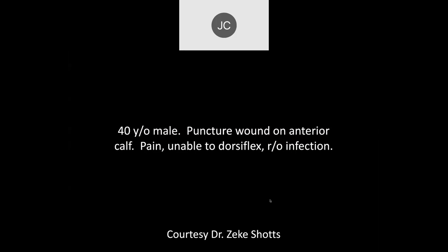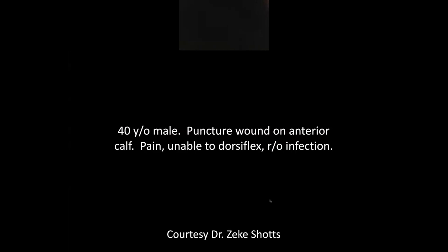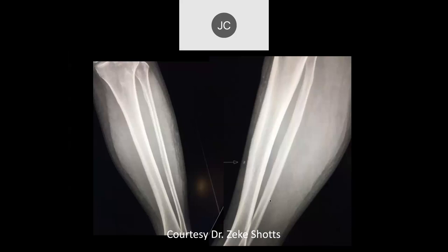Okay. Oleg. Forty-year-old male, puncture wound in anterior calf, pain, unable to dorsiflex. What do you think here on the plain films? So there is an enlarged lateral compartment of the left leg, like thickened. You mean the subcutaneous tissues or?